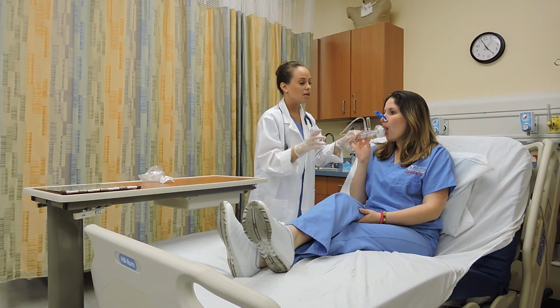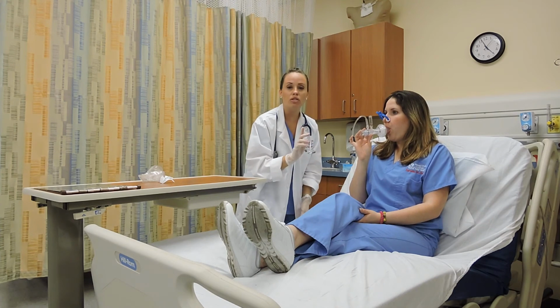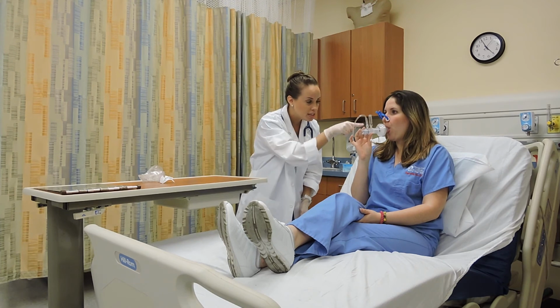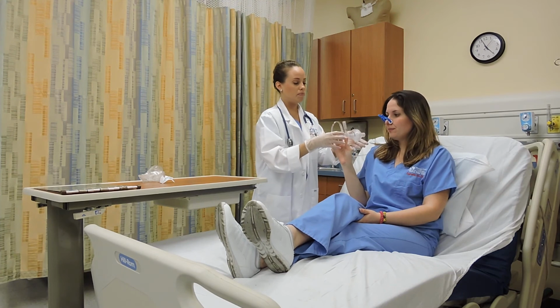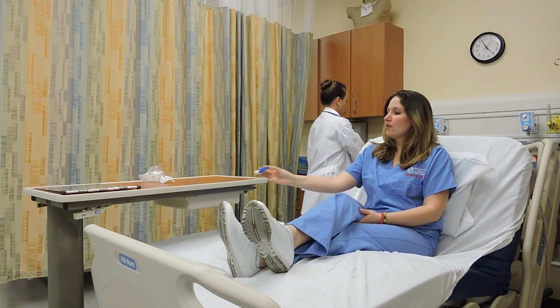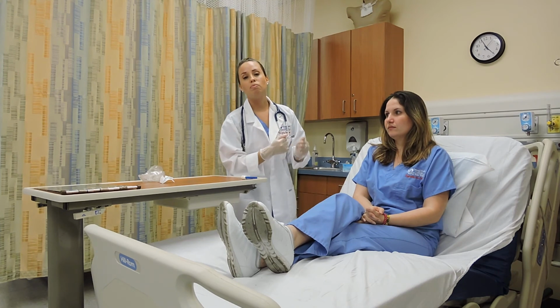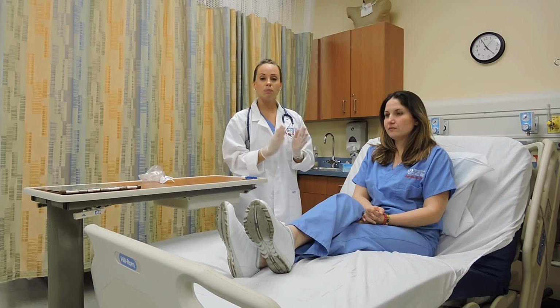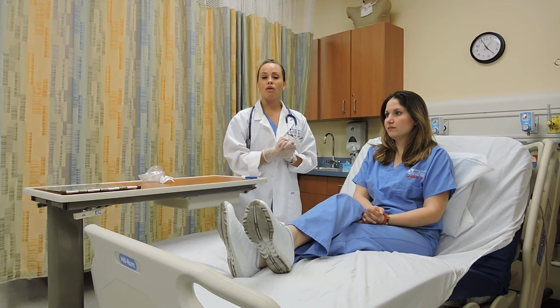Tight seal around, inhale, and exhale. Very important to let your patient know to exhale actively and not forcefully. Gently blow, blow a little more, 10 to 20 centimeters of water, and a good exhalation. Good, very good. Very important also to let your patient know that this cycle is to be repeated 4 to 8 times during 10 to 20 minutes. And if there is any expectoration, you should note sputum for odor, color, viscosity, and quantity.